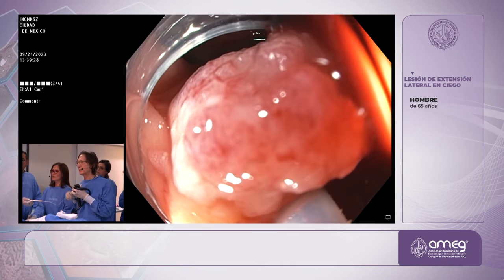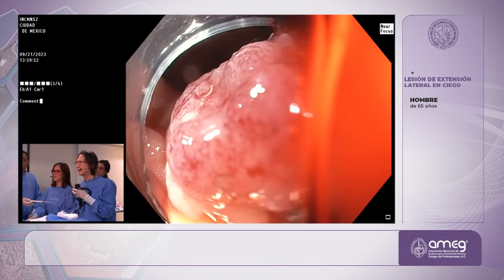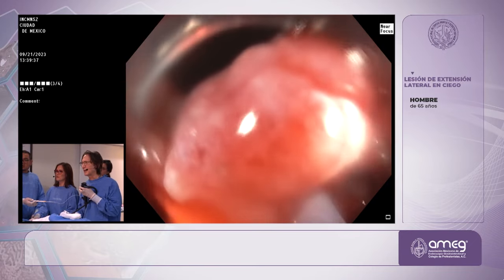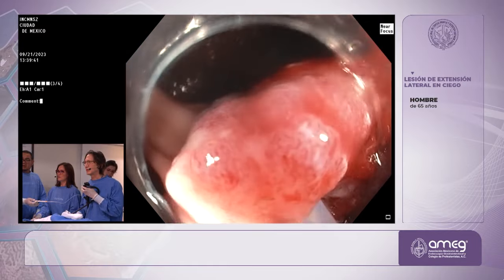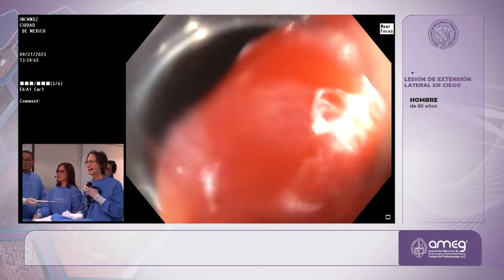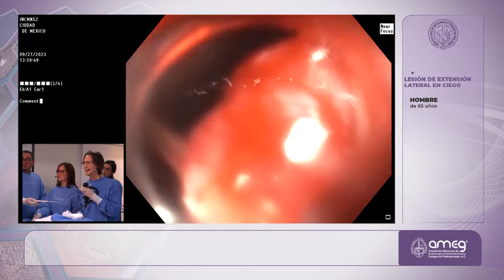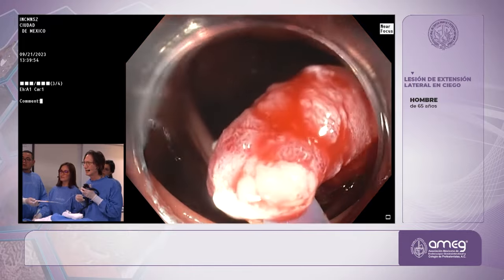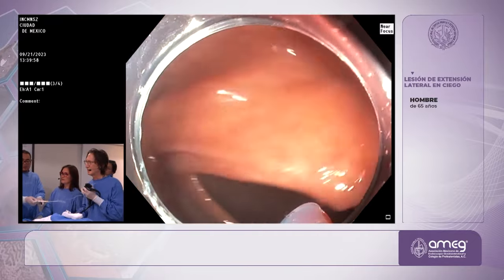I'll take off the near focus. Well, I guess I'll keep the near focus on, okay? And I'm just giving a little bit of coag just to start, and then we'll cut through. Okay. Cut and close. Did you close? Completely closed? Cierra, cierra. Yeah, close. Cierra, despacio. Is it closed all the way? Ya está cerrado toda? Is it through? No. No? You sure? Not yet. Really? Okay. Okay, now it is. Okay, let's see.